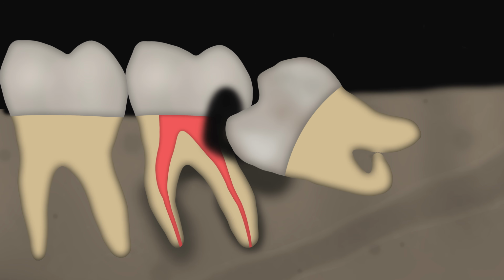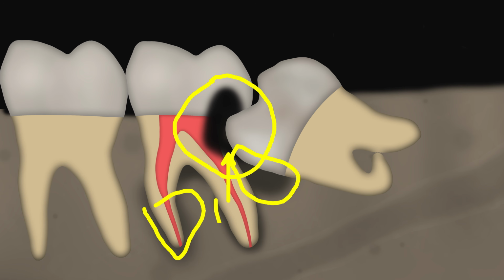understand their clinical situations. So we can see the radiolucency in the second molar is quite extending subgingival. You can see that it is quite close to the bone level or maybe below the bone level and below the gingival region, and there is a radiolucency with a bone loss below the crown portion of the third molar, and there is a widening of the apical region of the second molar.